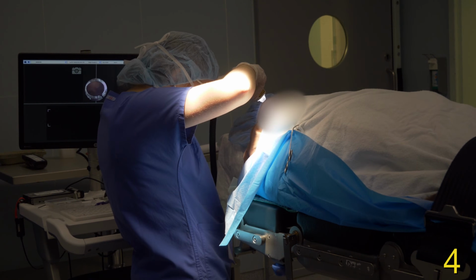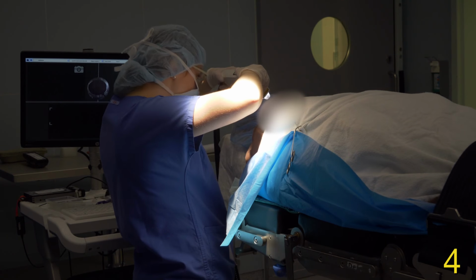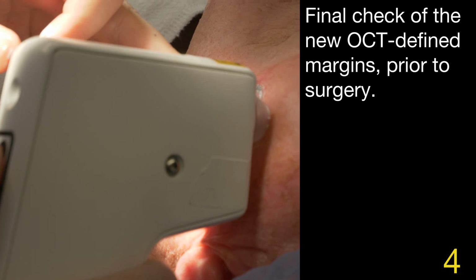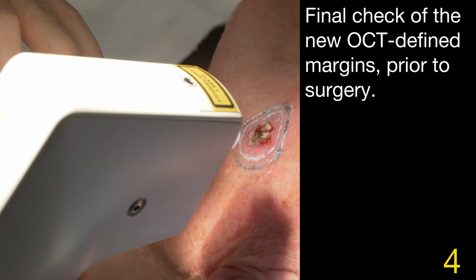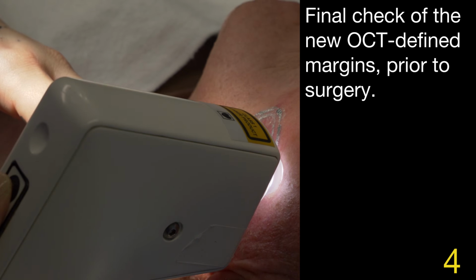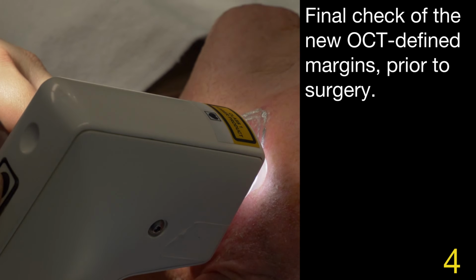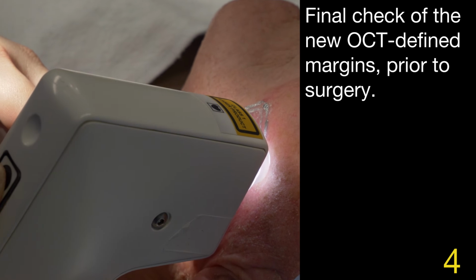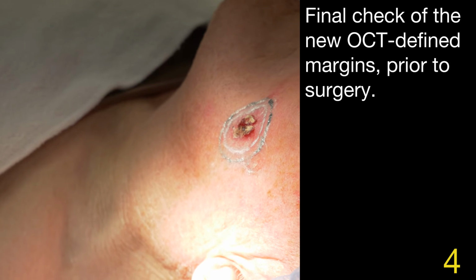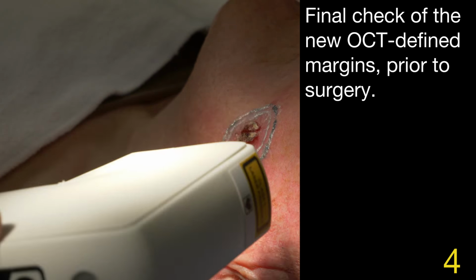Now we measure again. Okay, we place it again at 12 o'clock. We see the sign. And now it's clear. Okay, so we're fine. Then we place it again on the skin. We check for a safety margin again. On the margin. So essentially, once you've extended the margin, you do a final check. Yes, just to make sure if it's okay.